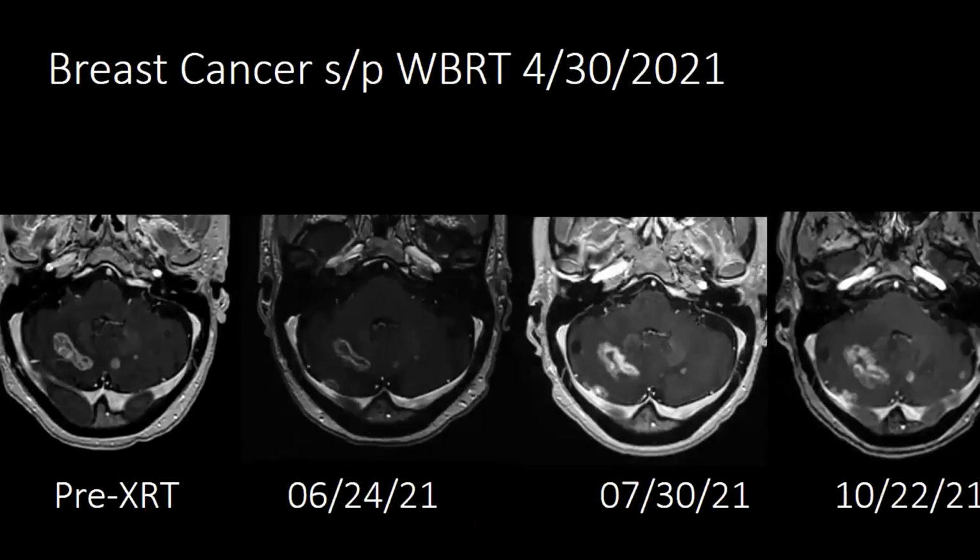Here is a case with breast cancer, and the patient had received whole brain radiation on 4/30/2021. I see I have the years right now. So the pre-treatment scan, you see you have a couple of lesions in the posterior fossa, the largest one on the right, heterogeneously enhancing. Post whole brain radiation, this has decreased, as have the others on the contralateral cerebellum.